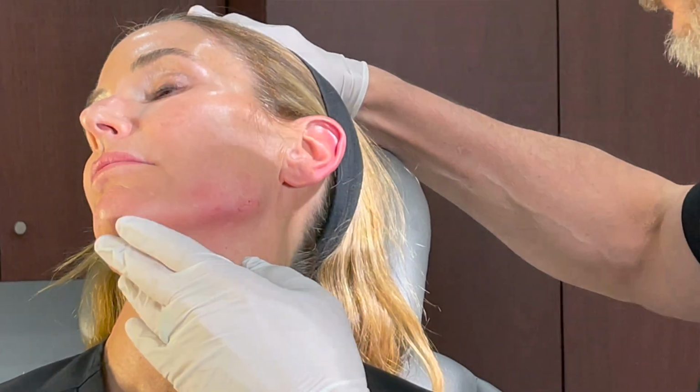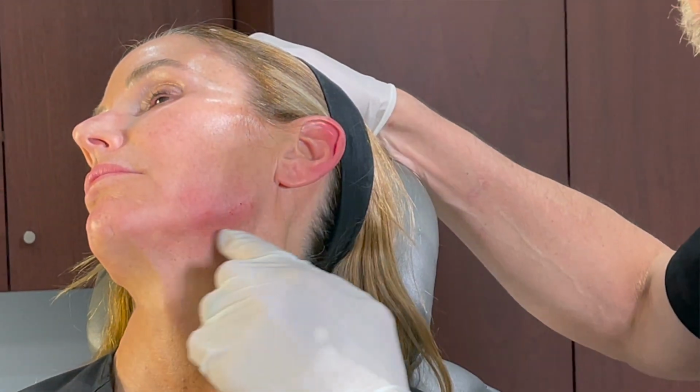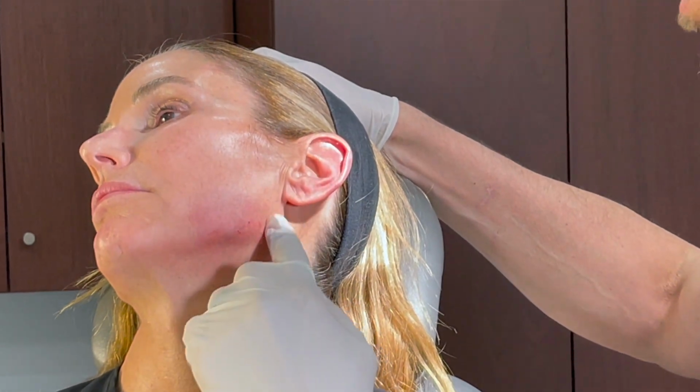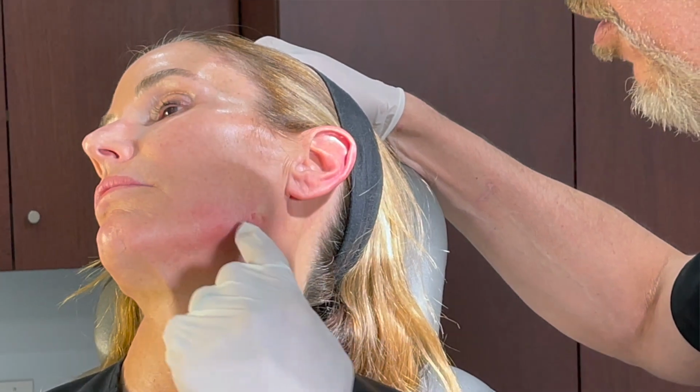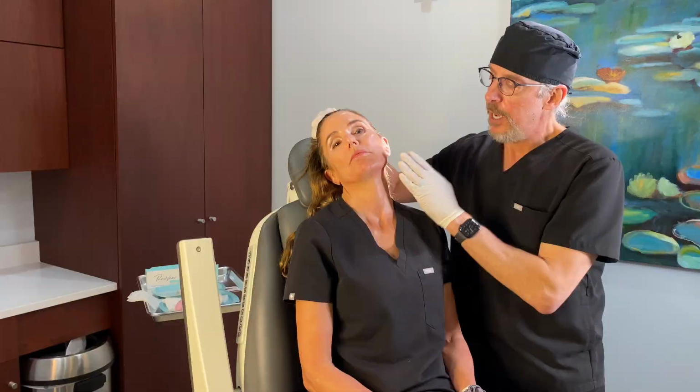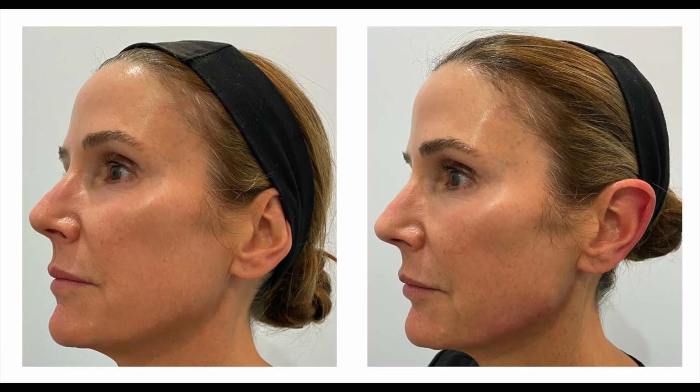As you can see right here, we have a much stronger, more defined jawline. We have a retromandibular fossa. We have more prominence of the gonial angle, and a very straight jawline. This is the before on the left and the after on the right. You notice the mandibular border is more defined and there is good shadowing underneath the mandible and in the retromandibular fossa. So I hope you enjoyed that video.